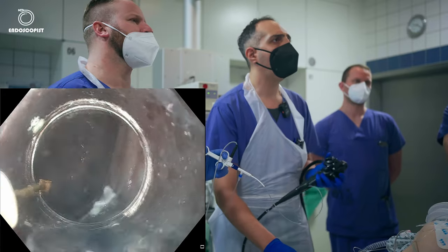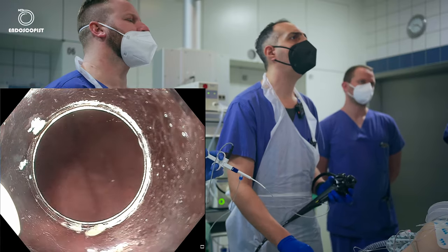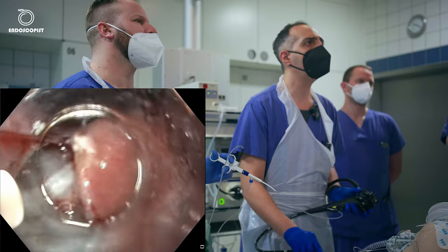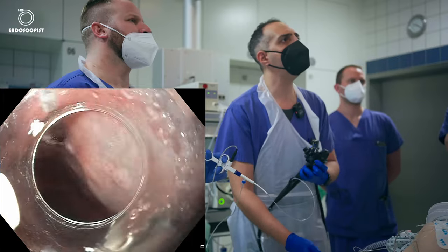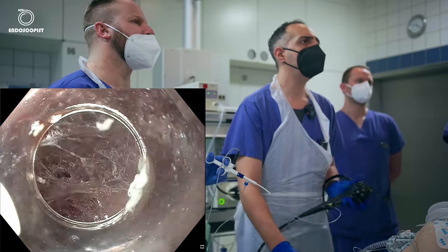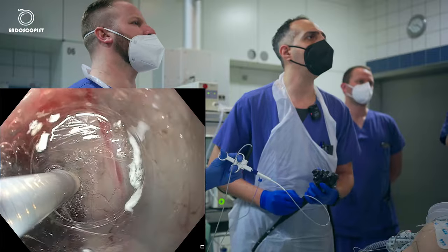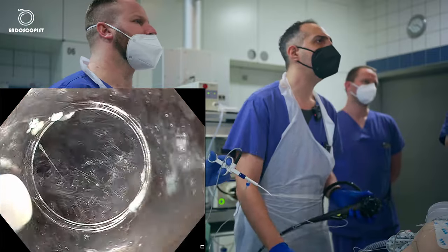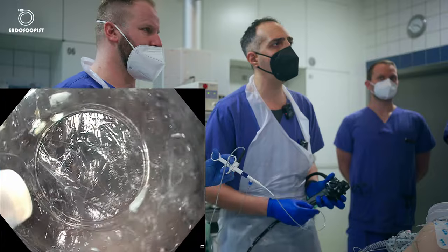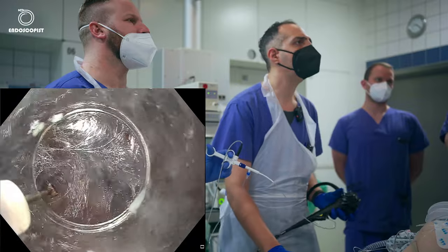After I open the tunnel, I will go once outside just to orient myself in this direction, and to see in which direction we should go. And we'll come again in the tunnel. As you can see here, it's a tiny opening, which I find it always very nice to have. I will keep the muscle layer downwards. And I will inject. So for the first 2-3 centimeters, I have to keep the muscle layer intact. Afterwards, I have to keep the mucosa intact. Fine.